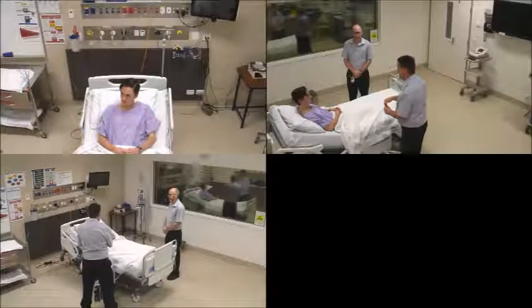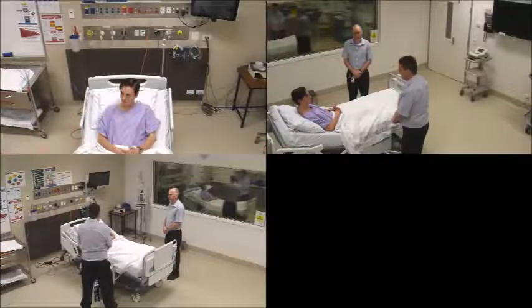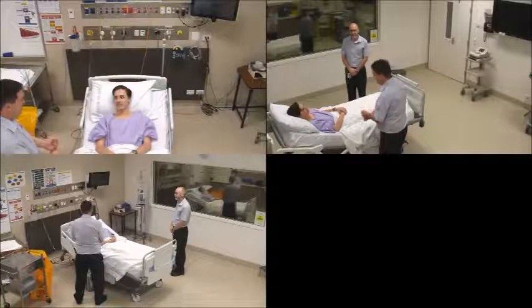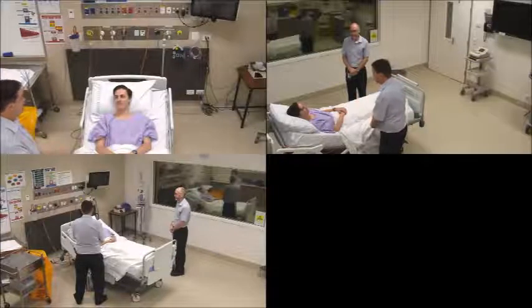So let's go through this step by step. Make sure that you've discussed with your partner the roles that you'll both be playing. Then talk with your patient, let them know what to expect, what you'll be doing, and the role of the assistant. Also let them know that you'll need to pinch their skin during the removal process and why you're doing it. Then determine if they need any pain relief. Not at the moment, no. Oh, okay.